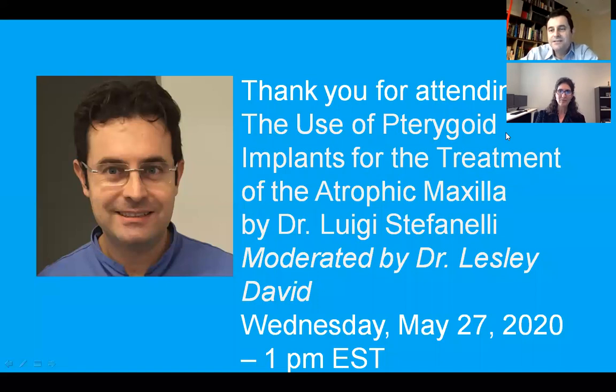There is a very interesting paper published by Breling, in which he planned and inserted zygomatic implants and pterygoid implants by using static guides. When he inserted the pterygoid implants with the static guides, he was able to use just the pilot drill because the limited mouth opening was an obstacle to pass the other drills and to insert the implants.